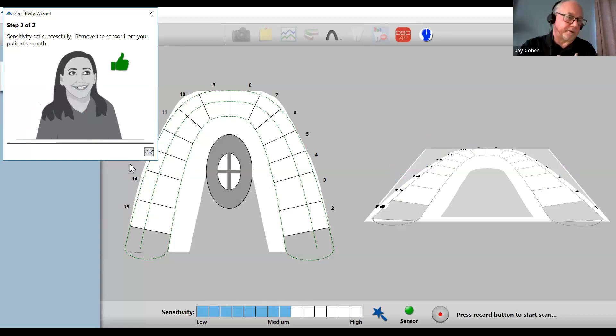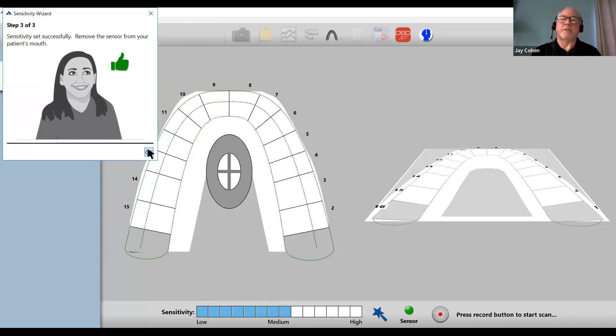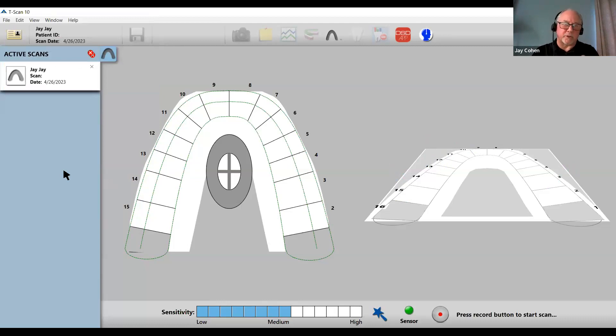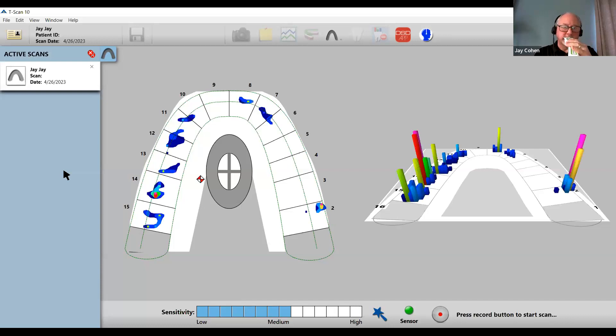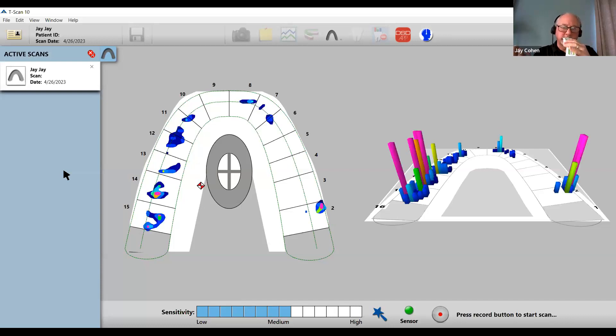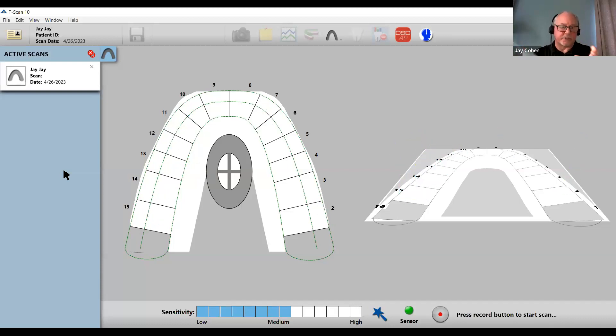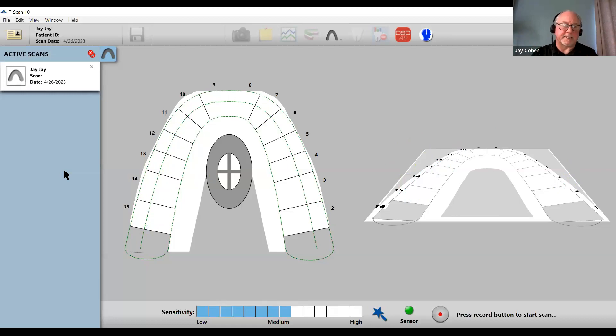She's happy, thumbs up, it's a good sensitivity. What I like to do, however, is after the sensitivity wizard sets the sensitivity, do one more test bite. I just want to confirm that I like it. Sometimes you still have to manually go back to the manual sensitivity control and tweak it a little bit. I like it, I'm seeing two to three, three to four pink. I'm in the right zone for my force zone.